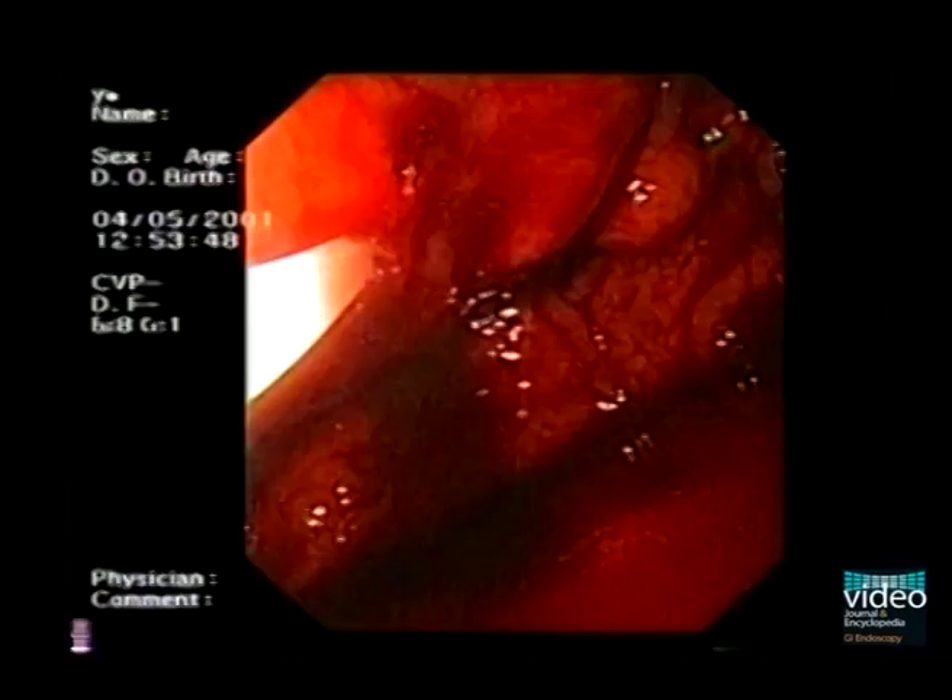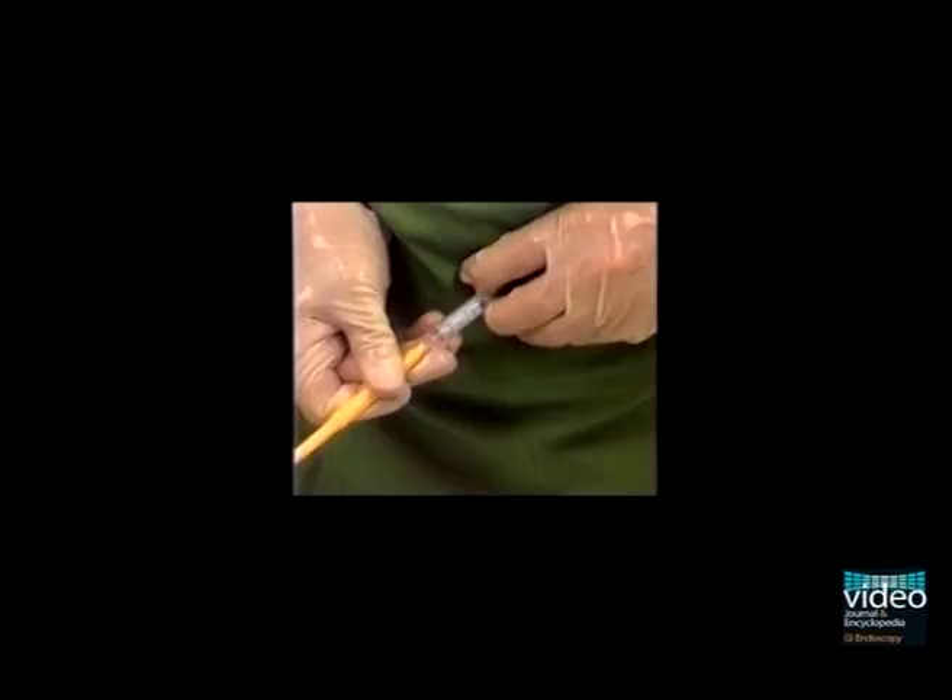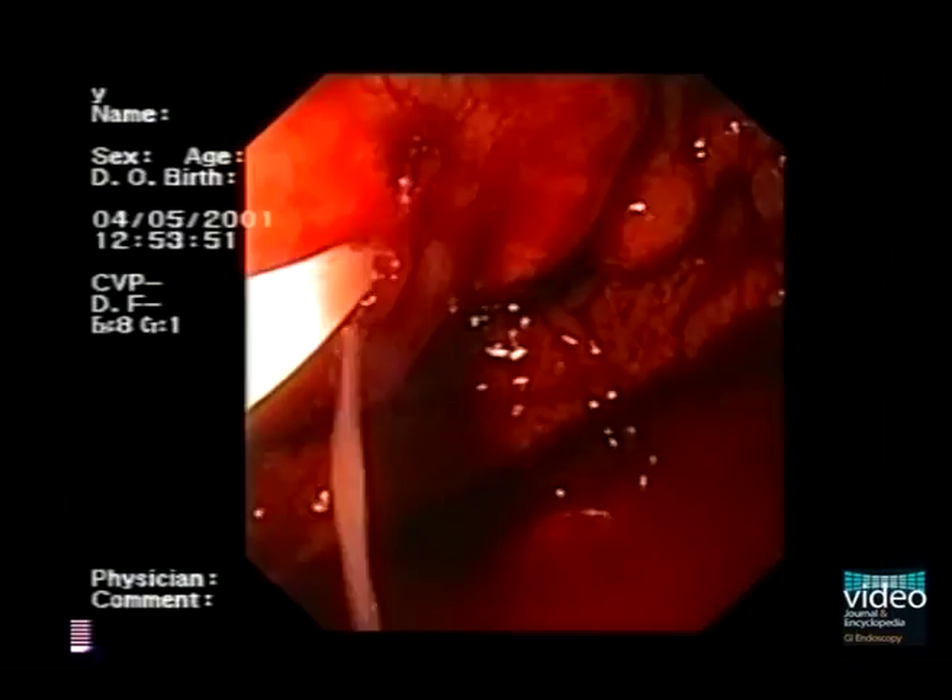The assistant announces the end of the injection and simultaneously withdraws the needle into the catheter. Now remove the injection catheter away from the varix and the assistant begins to flush the needle continuously with distilled water to keep the needle patent for the next injection. Here you see the glue spilling off the rupture site.